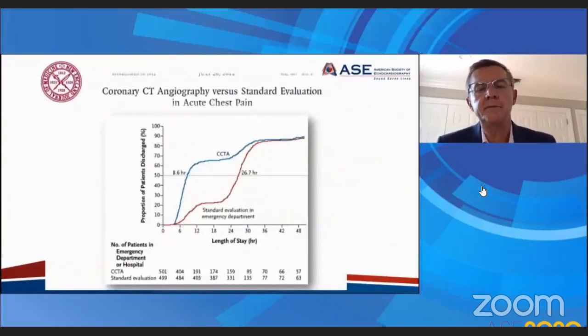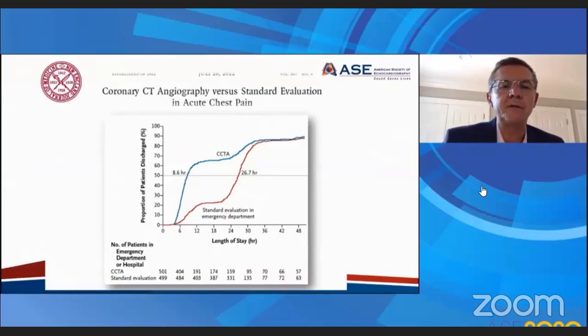In the emergency room, CT represents an ideal modality. It only requires imaging once. It doesn't require the patient to be stressed for the procedure, provided the patient doesn't have some of the contraindications that I will discuss later on. CT can be done relatively quickly, and studies have demonstrated that you can discharge patients from the ED much sooner than when they're evaluated with a conventional approach that often involves functional imaging.